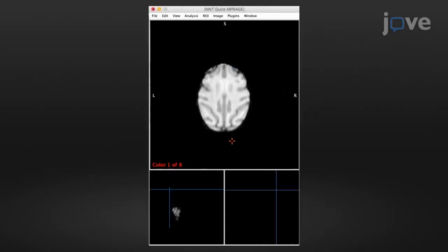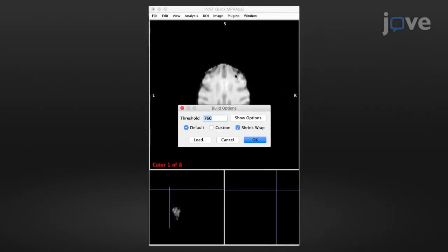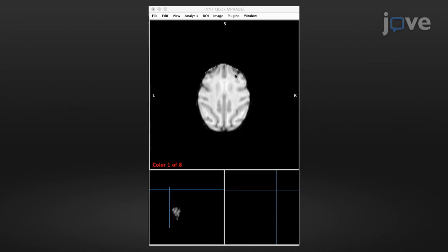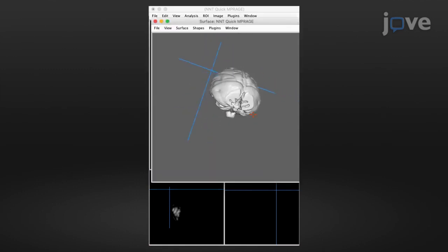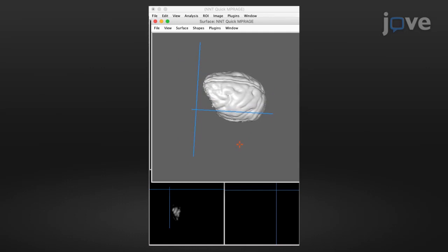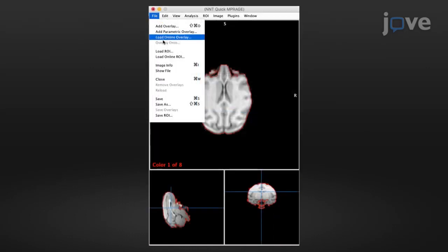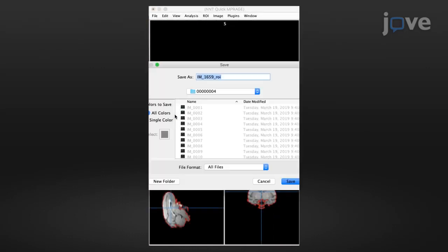After creating a bitmap of the brain image, select Build Surface under the Image menu and input the threshold used to create the bitmap containing the region of interest. Then click OK to create the surface and save the extracted brain region of interest as a .nii or .nii.gz file.